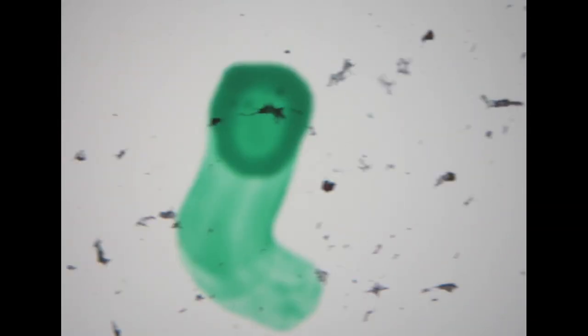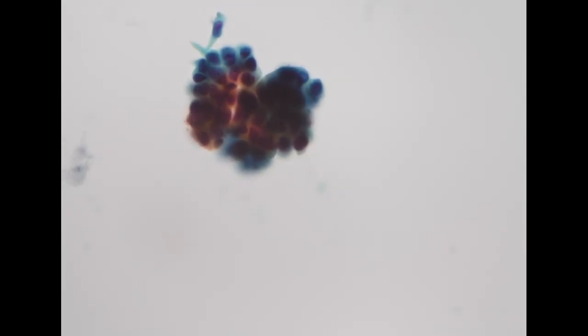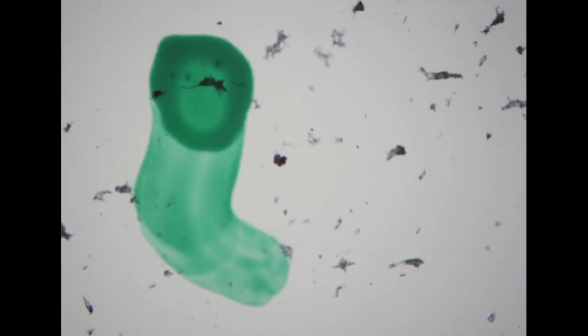Again, the cellularity is not very high. However, because it is inside the bone, I think it's diagnostic for adenocarcinoma metastasis. So we call it positive. And because the patient had a past history of lung cancer, it is compatible with the lung.